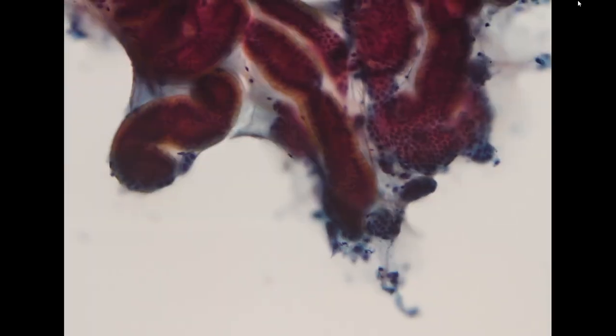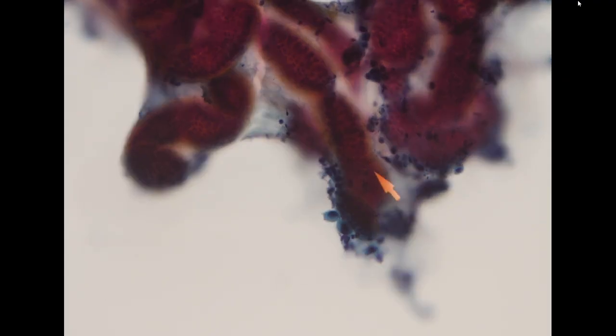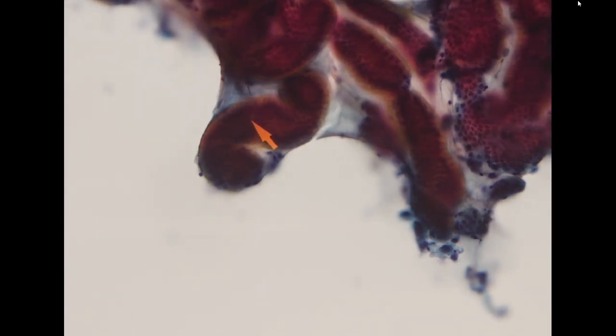This seems to be quite well differentiated. However, we do see some mucin, but the glandular differentiation is actually not normal in the pancreas. In the pancreas, usually we won't see these types of mucinous differentiated cells.